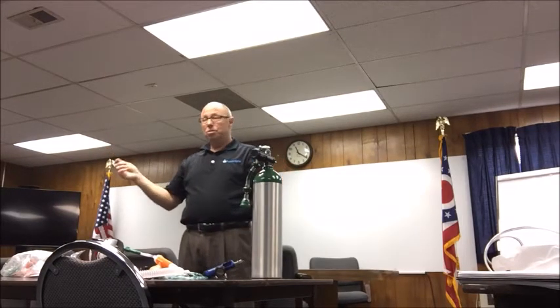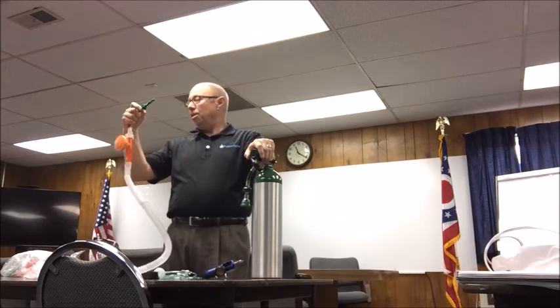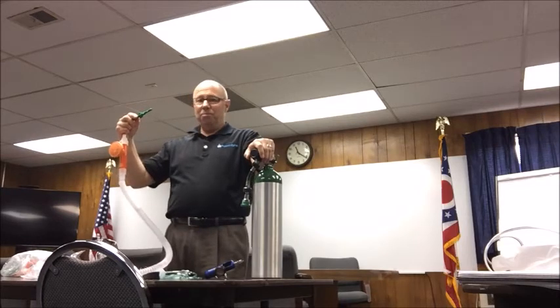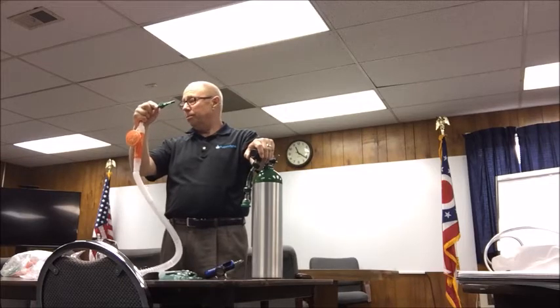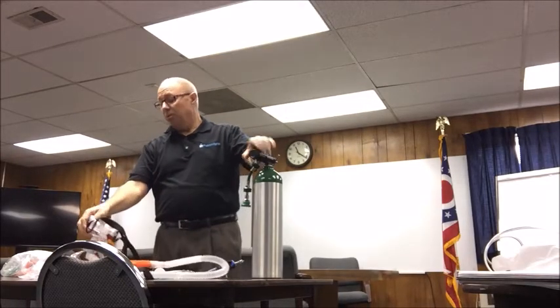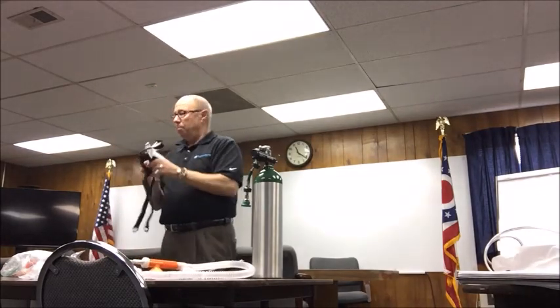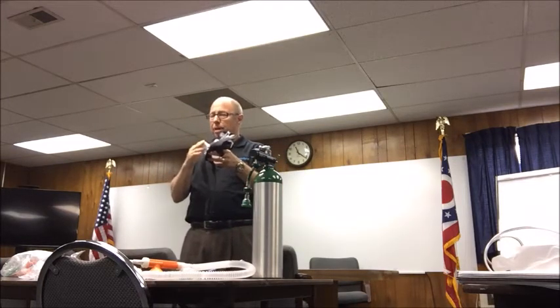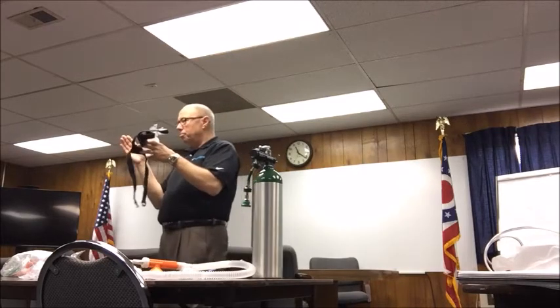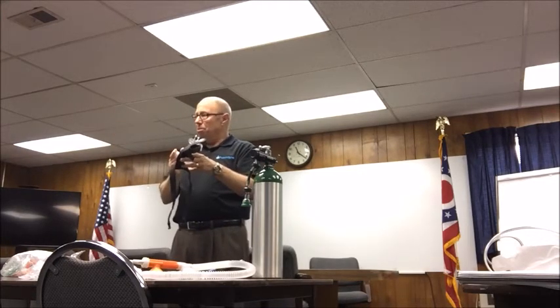You had to wait. So when you get to the hospital, if you have the Omida or whatever, and I don't know what the hospitals have there, some just plug it right into their oxygen tree, and you're gone. With this being a hospital grade mask, what's the first thing they do when we get to the hospital? Yeah, rip it off. Their V60, their BiPAP will fit into this mask. So if you can talk to the therapists in the hospital, or the nurses, to continue that care, put them on the BiPAP right into this mask.